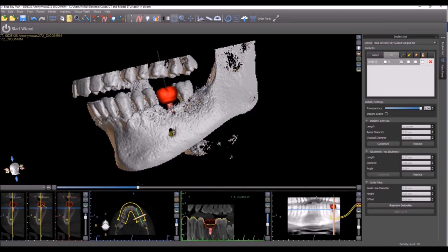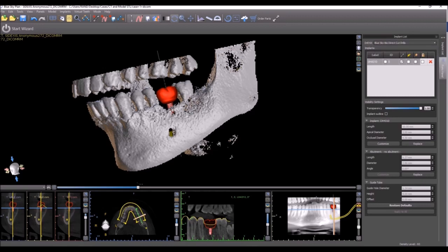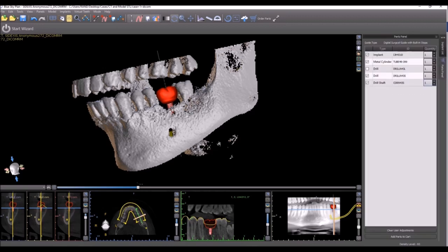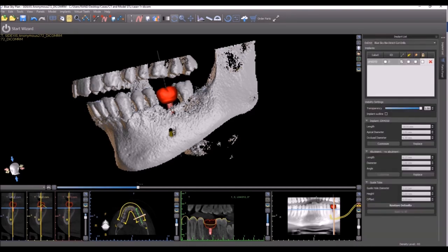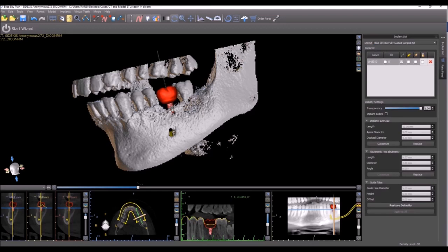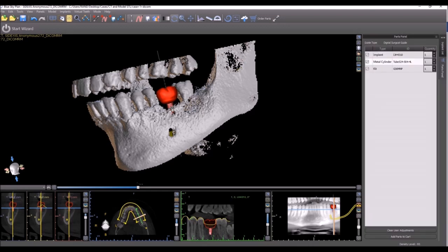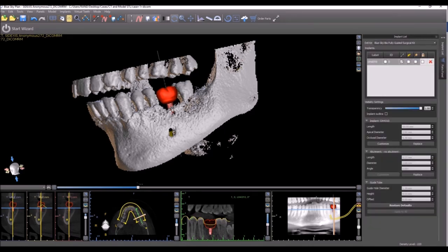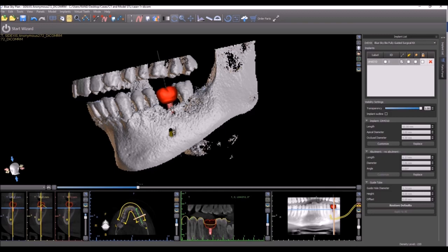Now, the same happens. Let's switch it back. Let's look at the parts panel. What's being displayed here is the parts for the direct cut drills. Now, if we switch and go to the fully guided kit, switch back to the parts panel, then we see that the parts have adjusted and updated accordingly. Now, that's true with the drilling report as well. The data in the drilling report will adjust and display the relevant information depending on which kit is being used.